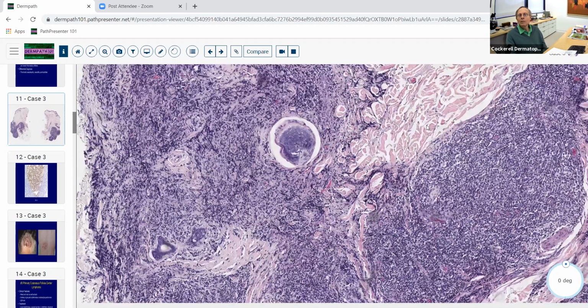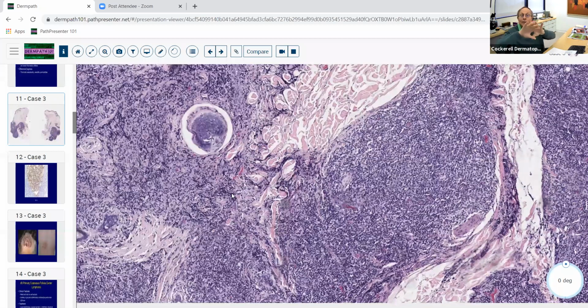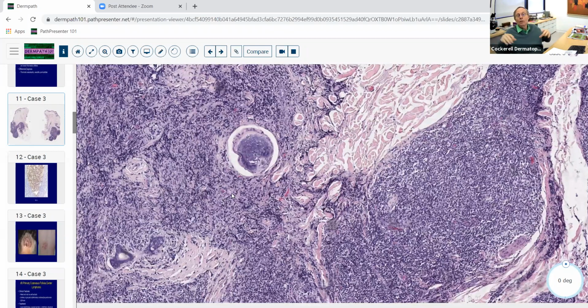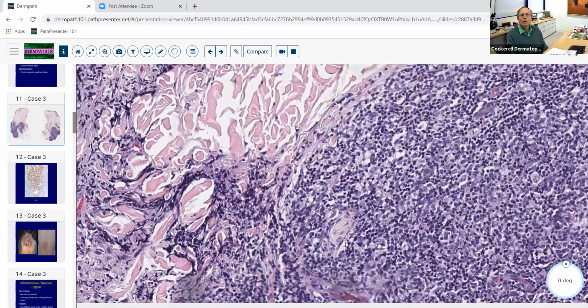So once again here, you've got this follicle, or what's sort of a poorly formed follicle, that's got a sprinkling of these lymphoid cells within it. So normally you get lymphocytes at the periphery, the nice follicle at the center. Here you've got the lymphocytes that have invaded the follicle, and here you've actually got the centrocytes of the follicle that kind of invaded outside their follicle area. So when you see that, that's a pretty good example histologically of what we call a follicle center cell lymphoma.